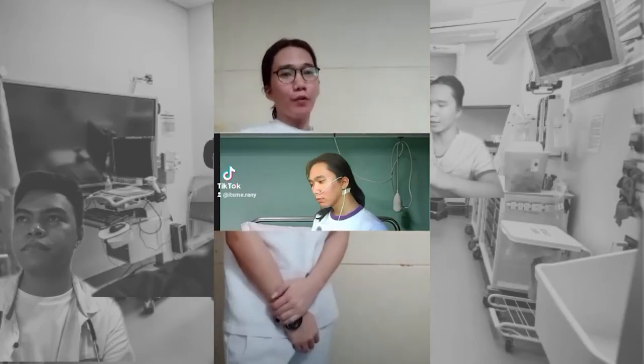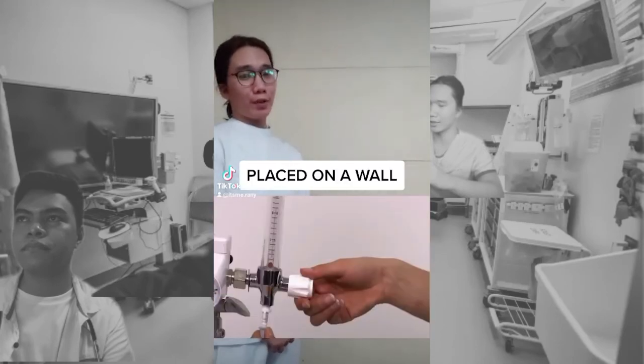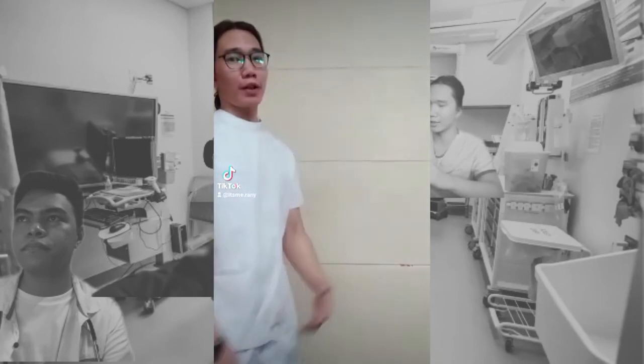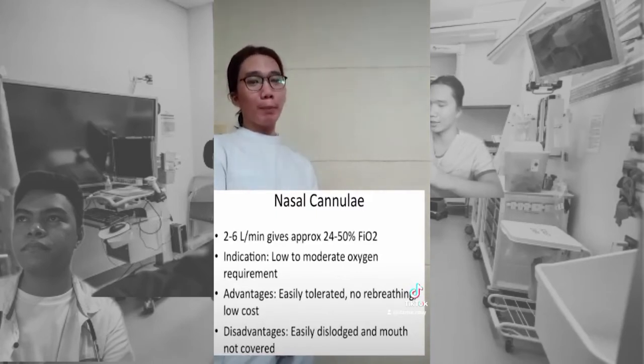The other end of the tube is connected to an oxygen tubing which then attaches to the oxygen cylinder, normally placed on a wall. You can control the flow rate using a flow meter. The design may vary between hospitals. The advantages of a nasal cannula is that it can deliver a flow rate of 2 to 6 liters per minute with approximately 24 to 50% FiO2.